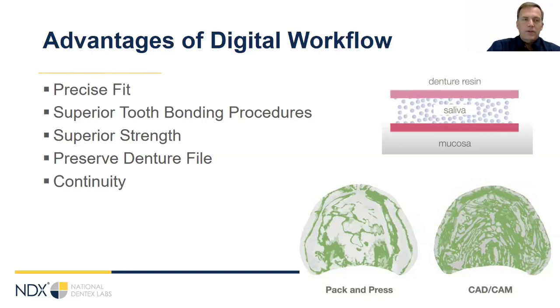Last but not least, you guys can save the files. So when the denture is done, you could ask your lab, hey, can you give me the files for the teeth and the base, or however your lab does it? And can you document what materials and shades were used? Because this is a rapidly evolving field. Over the next few years, probably your lab will find even better materials than are being used right now.